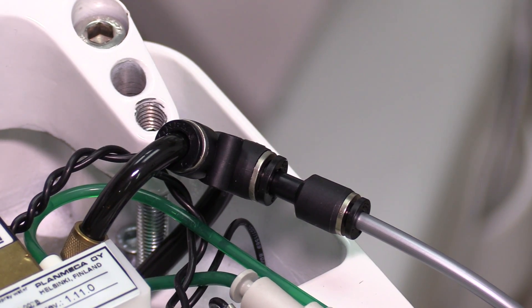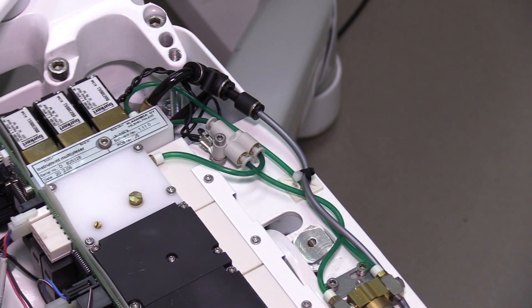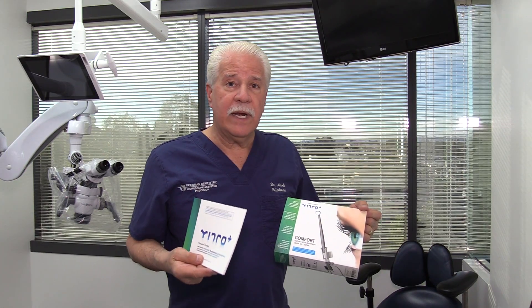We cut into the air line that goes under the doctor's side and run a small spaghetti tube. They even have a Plan Mecca hanger and they've got other adaptations for other units as well.